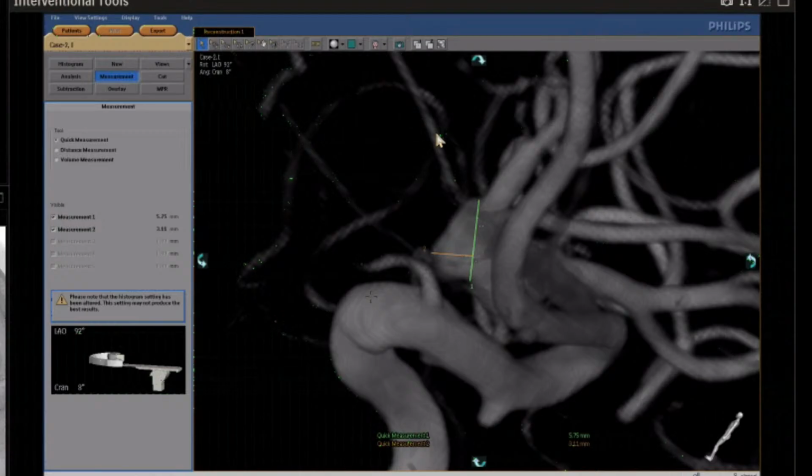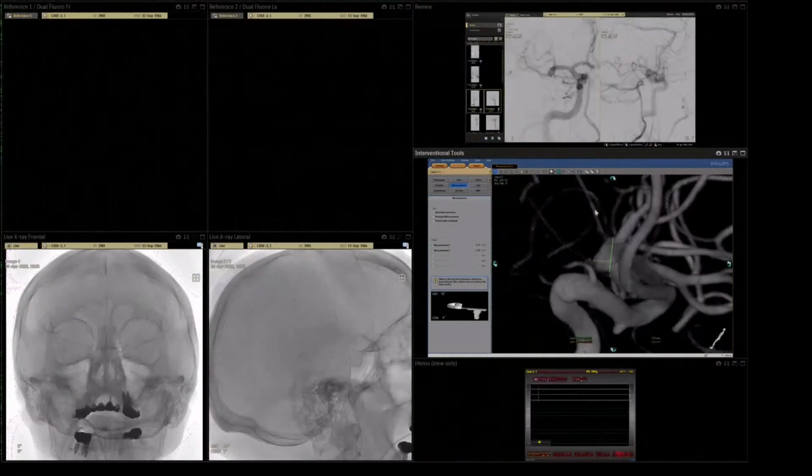I think this Eclipse single lumen. We'll use Gamma for coiling and Chikai black for navigation and Headway 17 for... no. We'll use just two instruments.